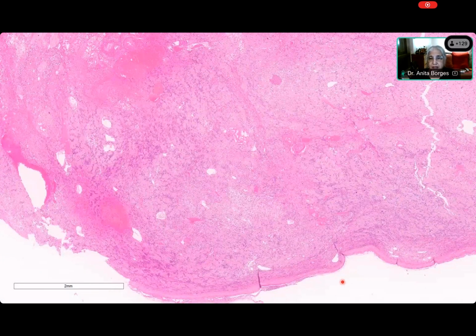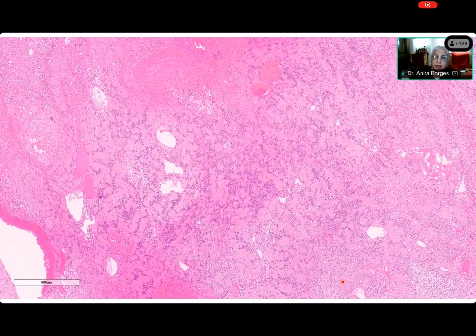Now what do you see here? Come on, Saida, quickly. Ma'am, the hypercellular Antoni A areas are in them, hypocellular Antoni B areas. Can you see any Antoni B areas over here? Where are they? What are you seeing over here, Saida? And the hypocellular areas. Which are the hypocellular areas? Now please show me the hypocellular areas. Saida, here. Show me the hypocellular areas. The pink areas. No, show it to me. Use the second pen. Oh, this. No, you're not using the second pen, because that's why it's disappearing.